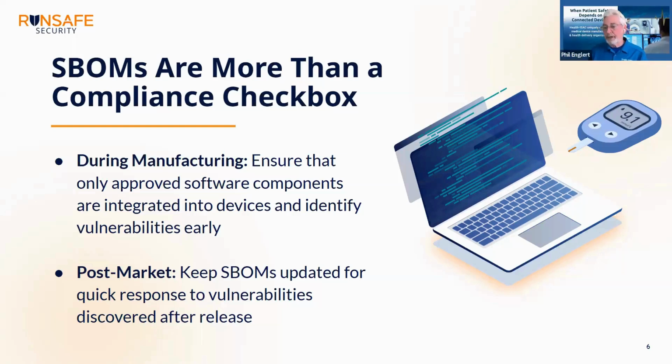Yeah, and that's a great point, right? I used to think legacy, they talk about legacy devices and how long lived they are. And the AHA, the American Hospital Association, puts out a book for the expected useful life of medical devices. And it was originally put out as a finance tool, right? How quickly, how many years should I depreciate the capital expenditure of this device over the course of its life? And even many of those start at 7 years. They stretch to 11 and even 12 or 15 years, depending on the types of technologies.